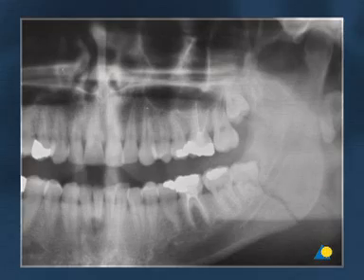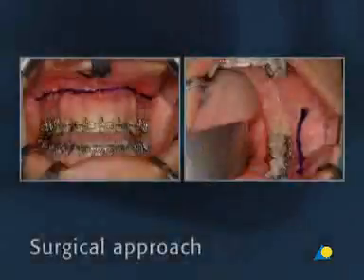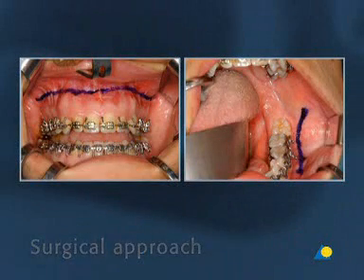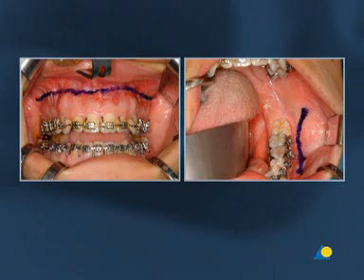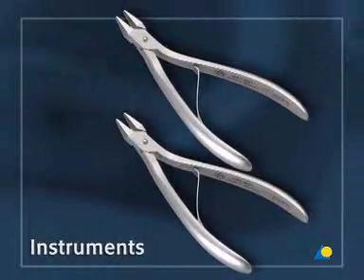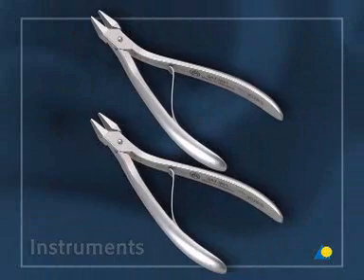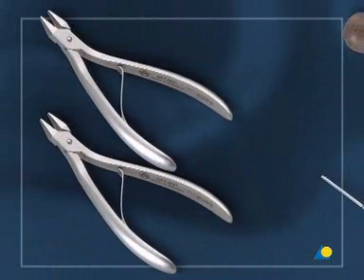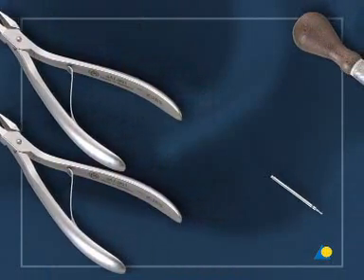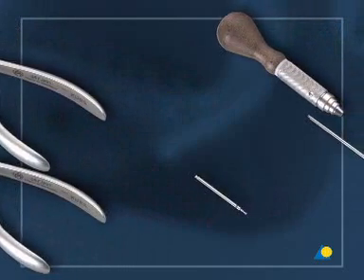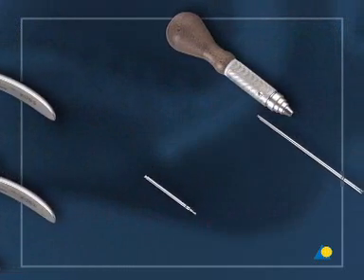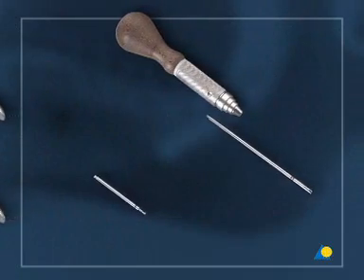CT imaging may be used as an alternative. In a clinical situation, access to this fracture would be through an intra-oral approach. In this exercise, the instruments needed are two bending pliers, the 1.5 mm drill bit with 6 mm stop, and the cruciform screwdriver shaft and handle.